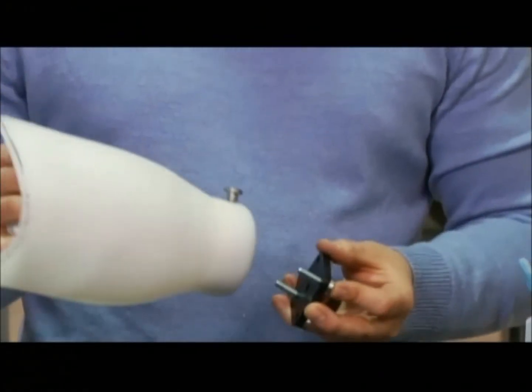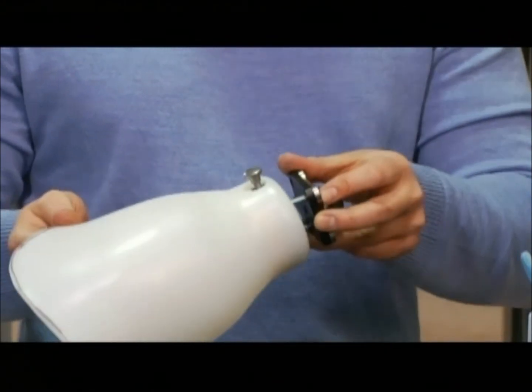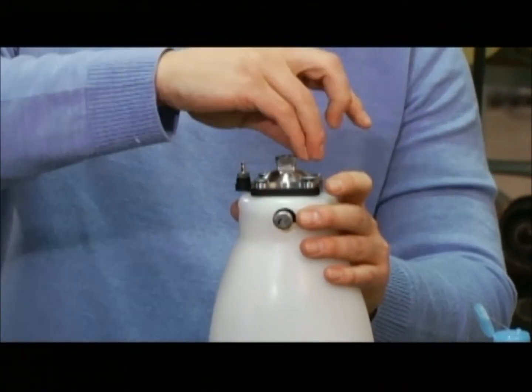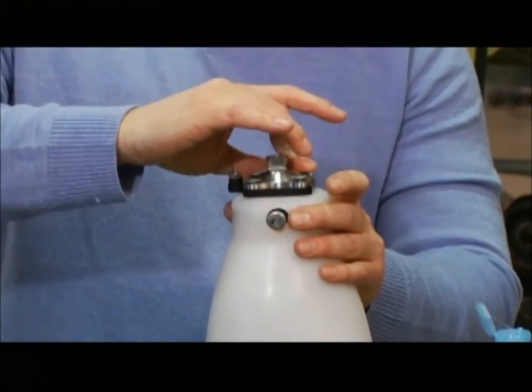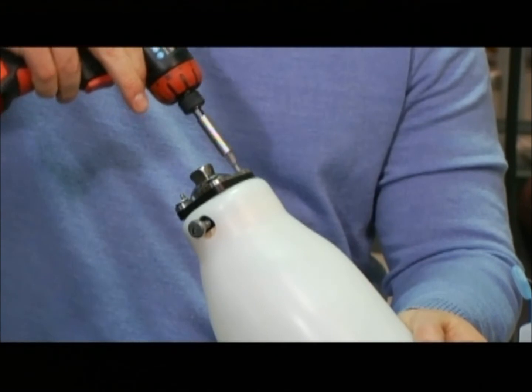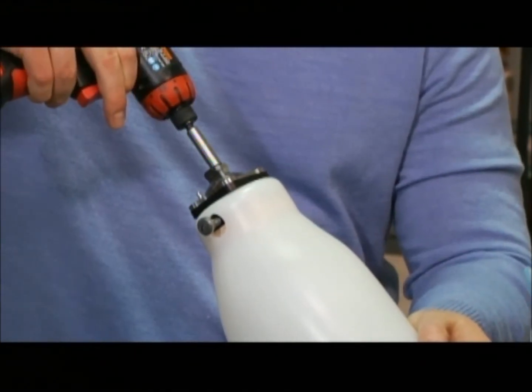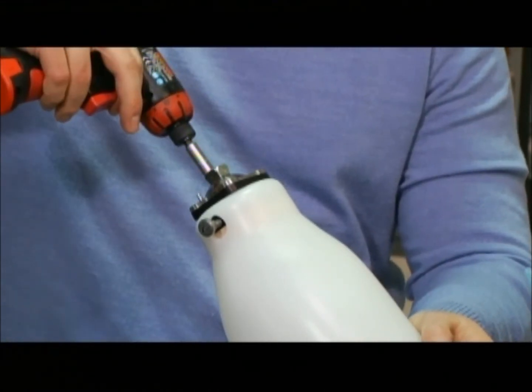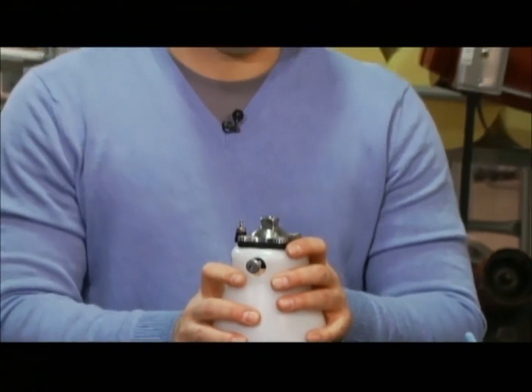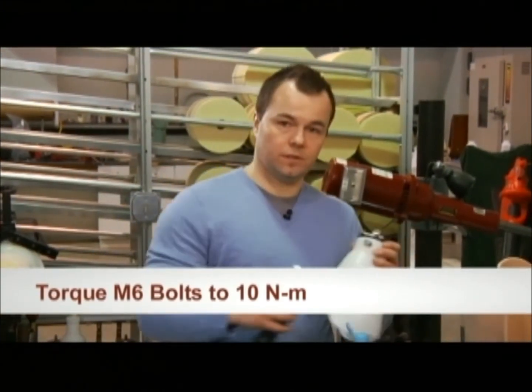If you use too long of bolts, they thread in through the distal end of the lock and push the urethane cushion up, which could affect the sealability of your socket. Once the bolts are installed, it's recommended that you tighten each of the bolts in the four-hole pattern to 10 newton meters using a torque wrench.